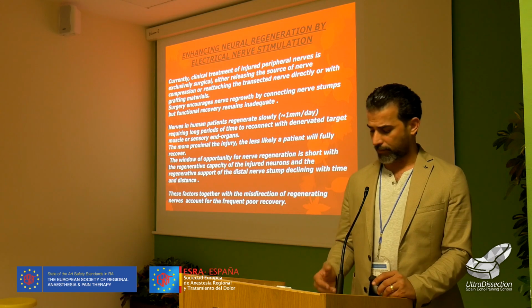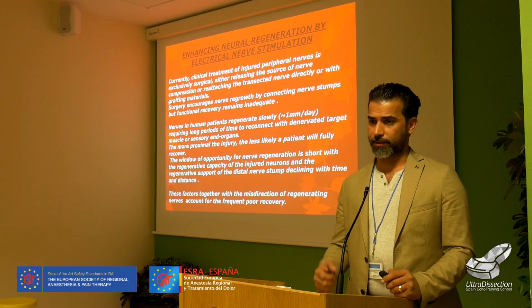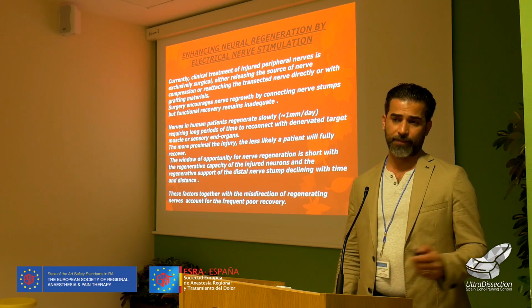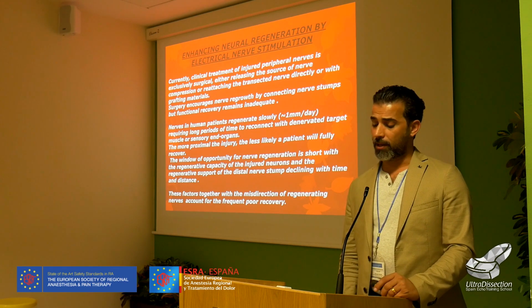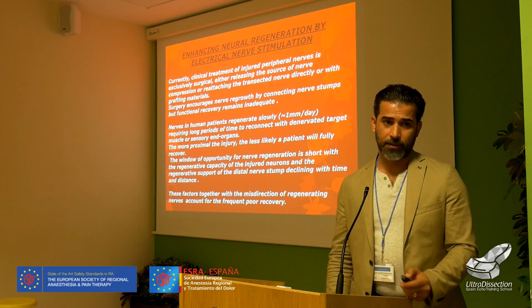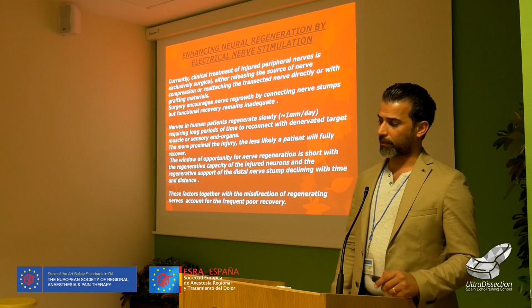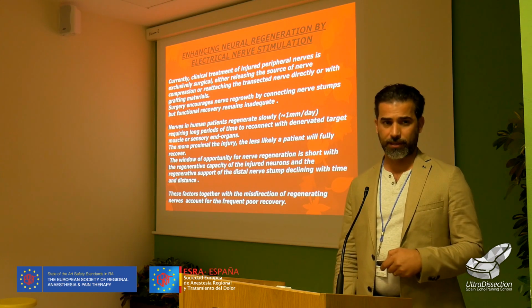By the way, this is important in our work also in peripheral nerve anesthesia, or regional anesthesia, because if you make a mistake and do an intraneural injection and nerve damage occurs after surgery, the patient will complain because of the motor deficit. Here you can use your techniques to manage your complication. It's written in the book, you have nerve complication after, for example, interscalene block, or after brachial plexus block axillary approach. Now, with this technique, you can manage your complication also, not just give the anesthesia. Give anesthesia and manage the complication if it occurs.